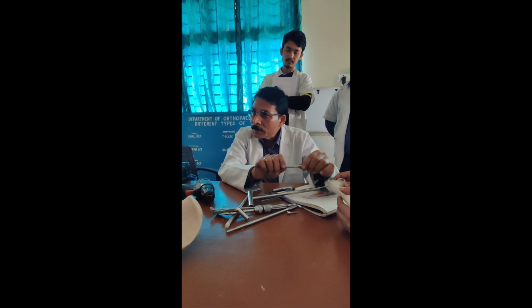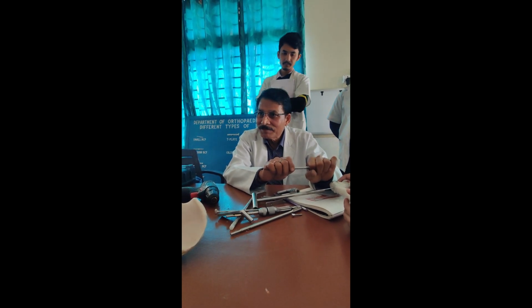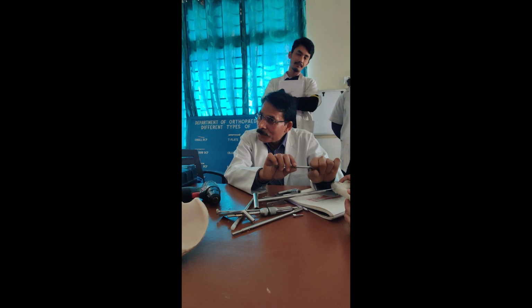Particularly in a hard bone, while you are locking, now it is stuck strongly. And if you try to do more rotation, what is going to happen? The whole fragment may move. This is another thing. Now it may dislodge because it is very tightly fixed over the tip. We have to adjust. Are you getting my point? This is a very important thing.